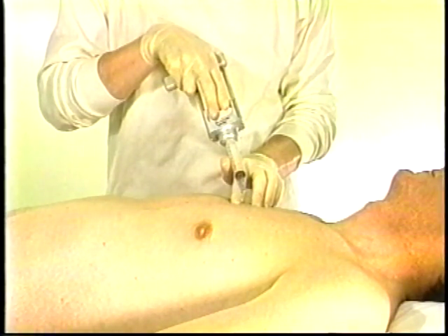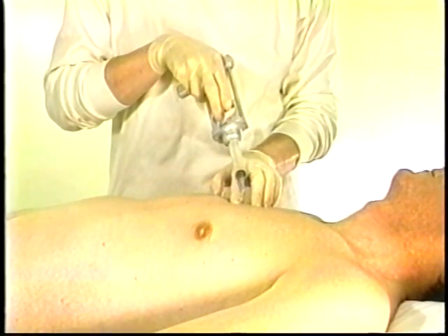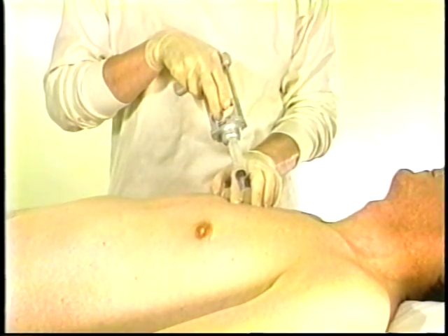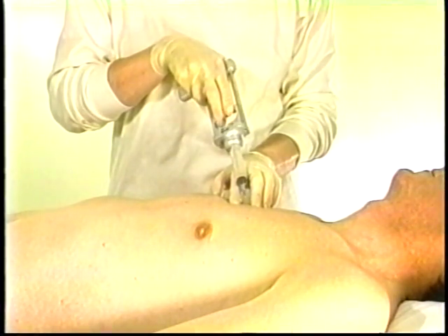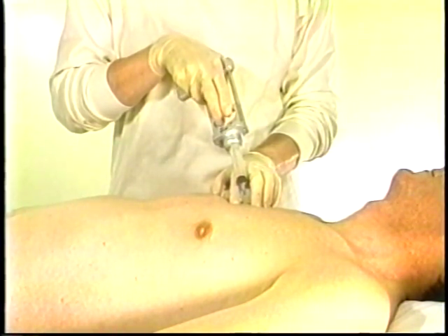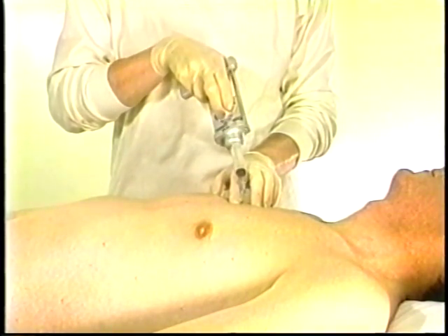I support the syringe with my thumb like this. Another possibility is to simply lean the syringe on my forefinger. The needle will enter the skin at an angle. Because of this, I will penetrate the skin a little below the mass so that the needle tip is heading straight for the center of it. I'm now in a good position to go ahead with the sampling and will move right along.